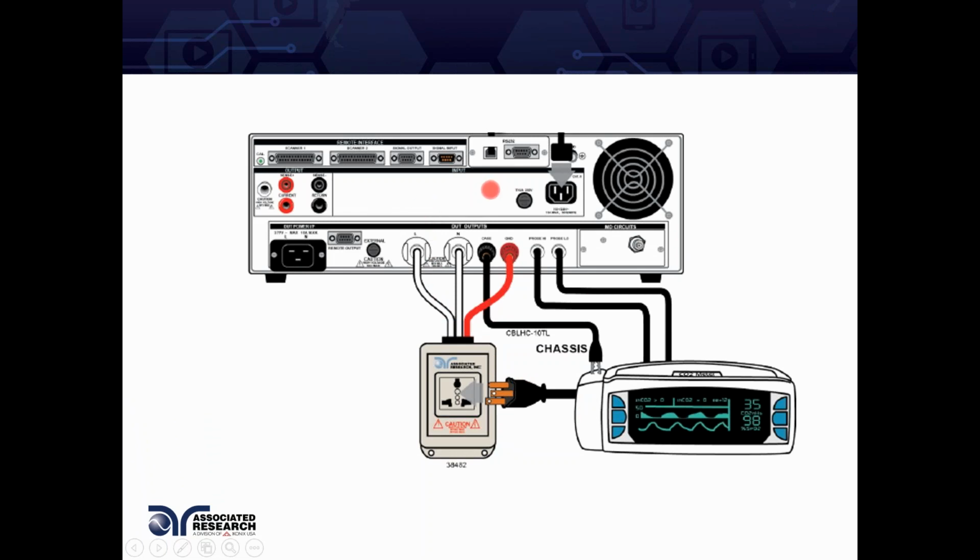Inside this unit, some of the equipment does come with an internal power supply that could output 264 volts. 264 volts are going to be outputted at line and neutral, and that would be enough to power up your product according to the standards. Now, you're overpowering the device under test to see if additional leakage could be seen compared to normal 240 volts. There are additional points that are taken into consideration where, if you're running some additional tests, you may or may not be required to have probe high and probe low attached to one of your products.